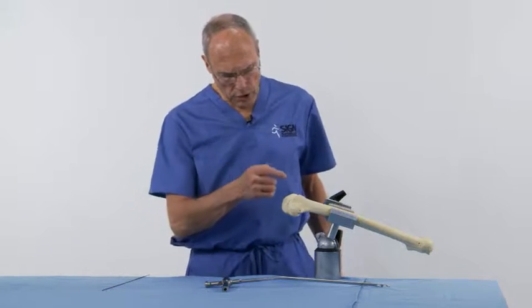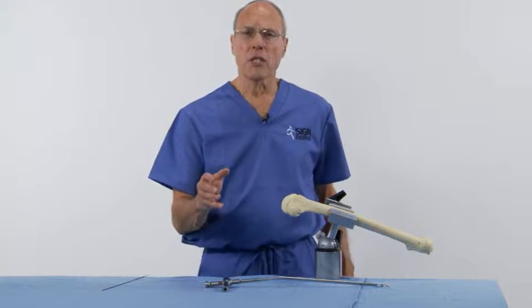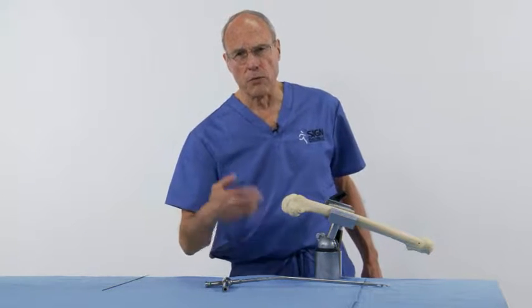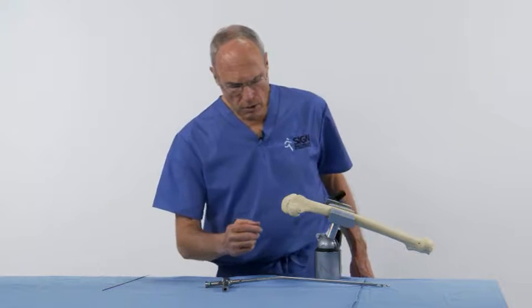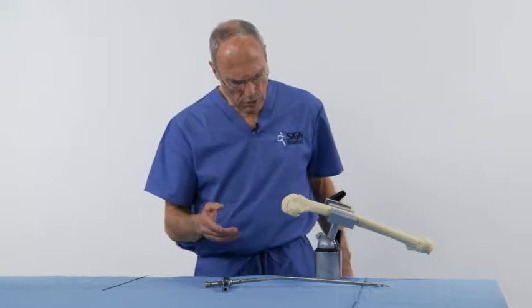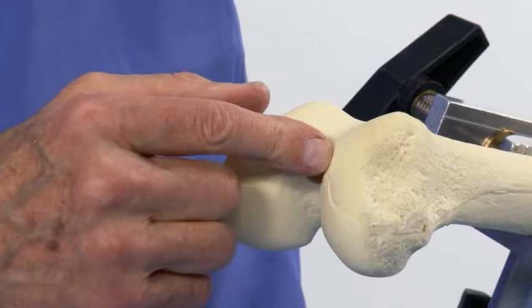It's left attached at the patella and sutured back to the tibial tubercle later at the end of the procedure. Once you have your incision through the patella tendon, and I would tell you that making the incision through the patella tendon is a lot easier if you can do this in maximal flexion because you can feel the patella tendon. Some people go medial to the patella tendon, and that's perfectly acceptable because the entrance hole is going to be in the medial side of the femoral groove.